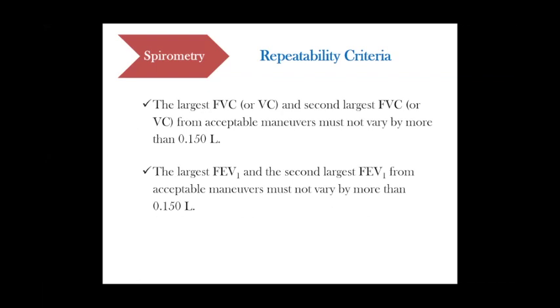For the repeatability criteria, the largest FVC and the second largest FVC from the acceptable 3 maneuvers that we obtained must not vary by more than 150 ml or 0.15 liter. Also, the largest FEV1 and the second largest FEV1 from the acceptable maneuvers must not vary by more than 150 ml.